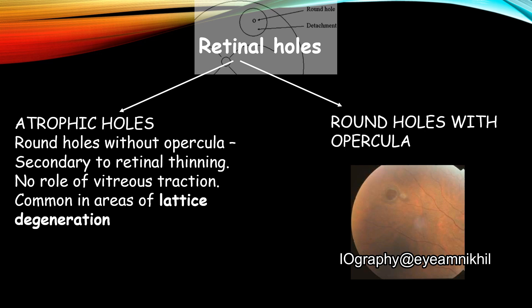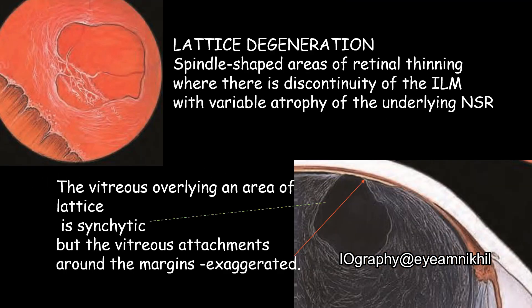A lattice degeneration is a spindle-shaped area of retinal thinning where there is discontinuity of the internal limiting membrane with variable atrophy of the underlying neurosensory retina. It is therefore a weak area which can develop holes. The vitreous overlying an area of lattice is liquefied and the attachments around its margin are exaggerated. It is due to all these factors that it can predispose to retinal detachment.